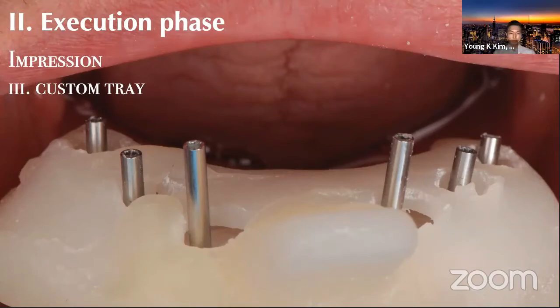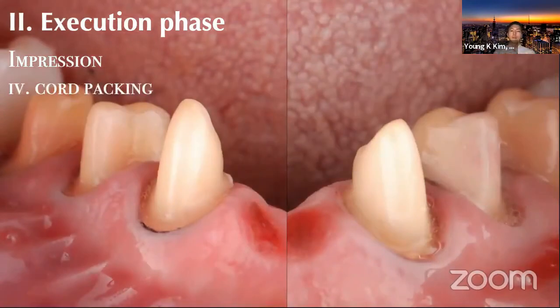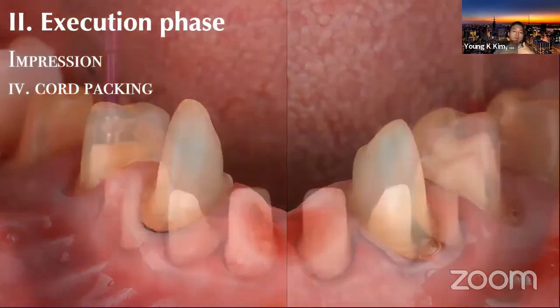And obviously at this moment in time, the soft tissue should be, no question, healthy, with biologic width. The patient should have been maintaining the soft tissue in an excellent way. If not, then again, I wouldn't have prepped the tooth. I prefer to put a first cord, the 000 cord most of the time, or a little piece of Teflon tape. I use a double cord technique: you put the initial cord for the vertical pushing, and your second cord will be the horizontal pushing.